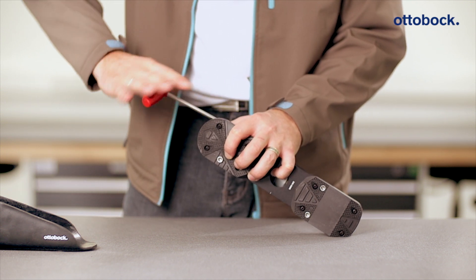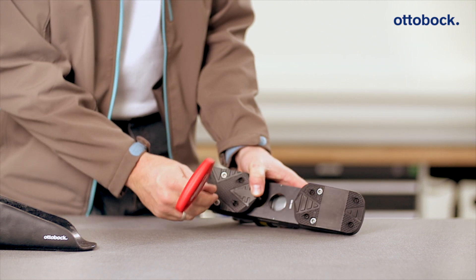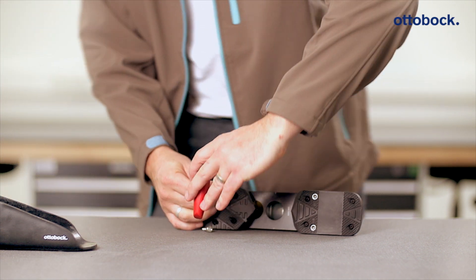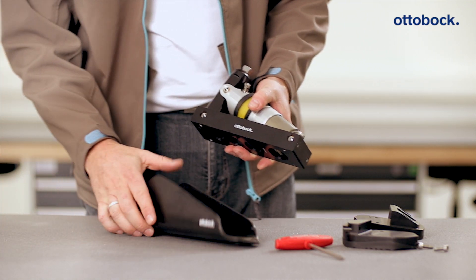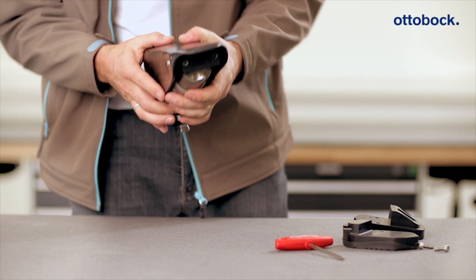The 1E2 prosthetic foot is equipped for use in a ski binding as delivered. If the prosthetic foot is to be used in a snowboarding soft boot, the foot shell included in the scope of delivery must be attached before the bench alignment. An example of this alignment is shown here for a lower leg snowboarding prosthesis.